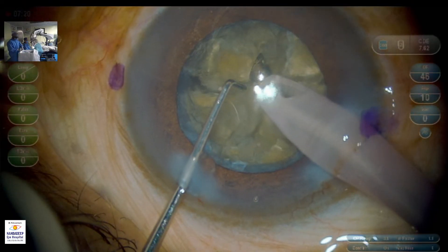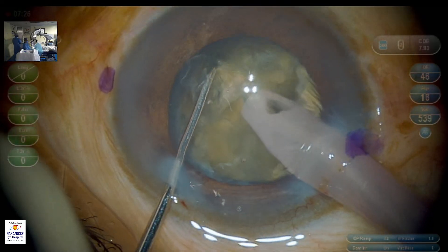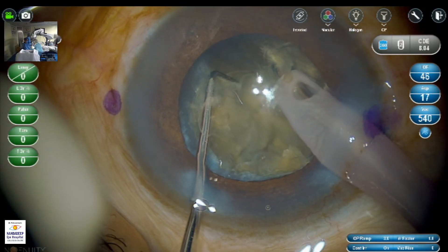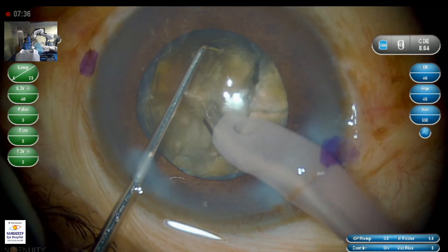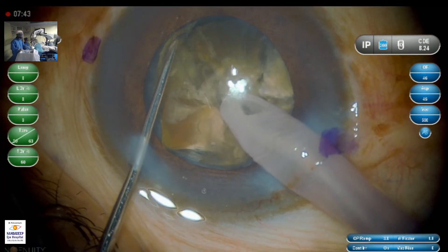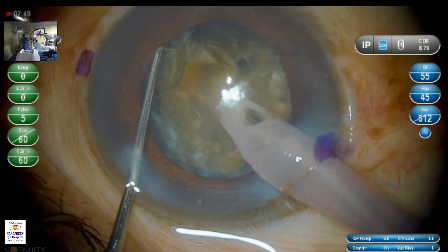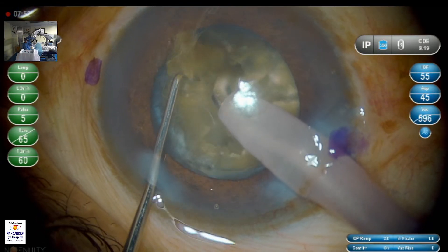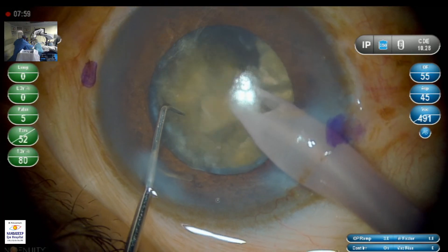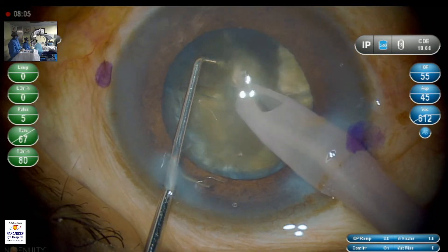The settings used for chopping are 70% power, which is used dynamically based on how much is required. The vacuum is about 500 millimeters of mercury, and the aspiration flow rate is set at 40. Now the chopping is complete, and we begin emulsification. You can notice that the piece is being held in vacuum and is only being emulsified in the center.